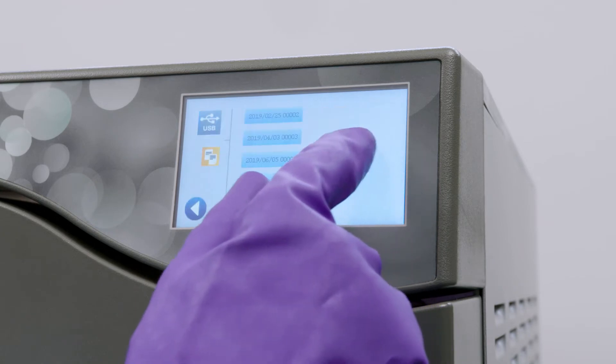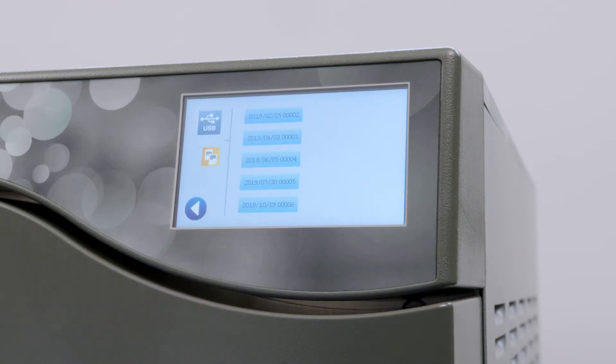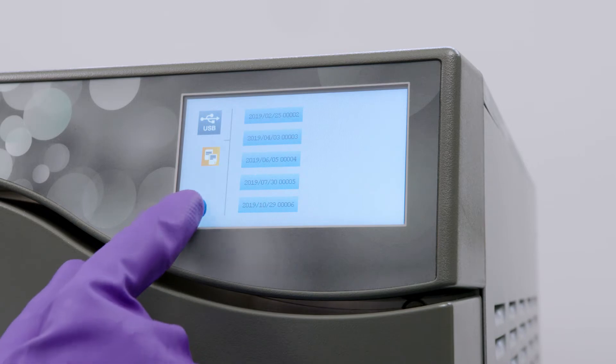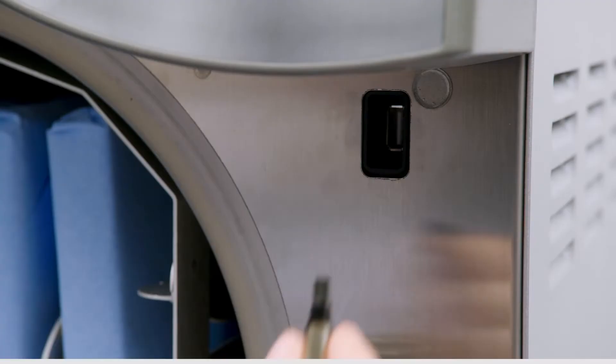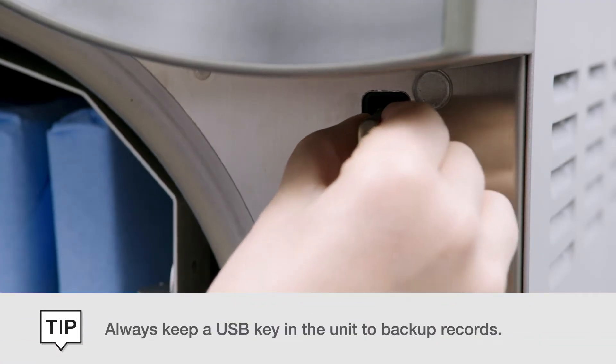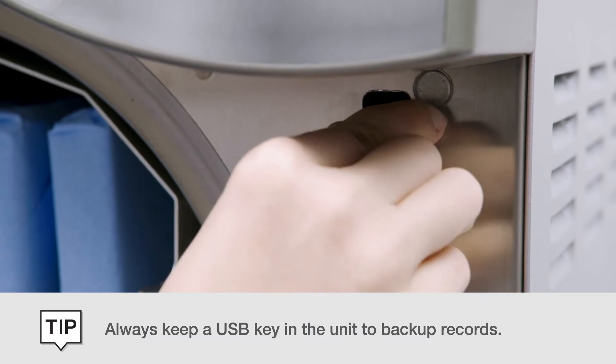When the USB icon is pressed, the display will show the last five completed cycles along with the last five incomplete cycles. When your unit is connected to the G4 network, all cycle data will be stored to the cloud. However, it is recommended to keep a USB key installed as a backup.